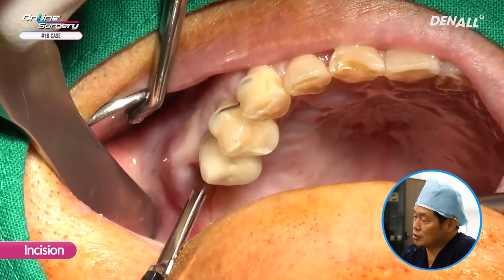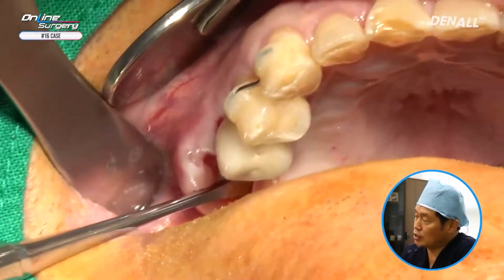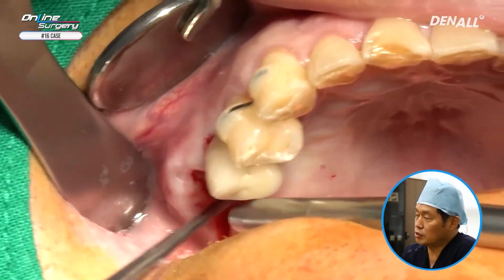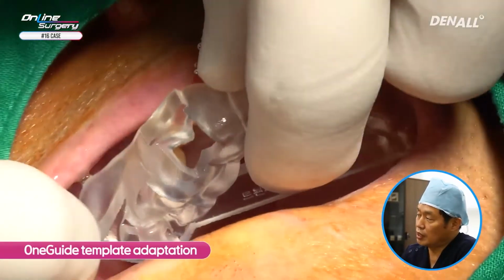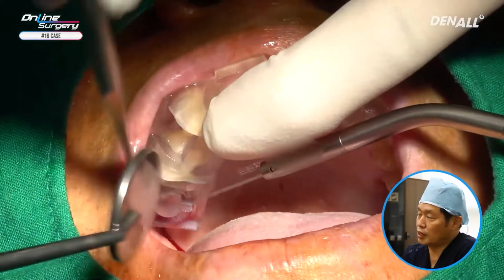Incision is being done. It is made from the distal side, almost as if you're pulling it. The reason why we do an incision is because when you use OneGuide, a lot of people use just a tissue punch. But for this patient, there's an insufficient amount of attached gingiva, so a small incision is made and the flap is reflected and the template is connected.